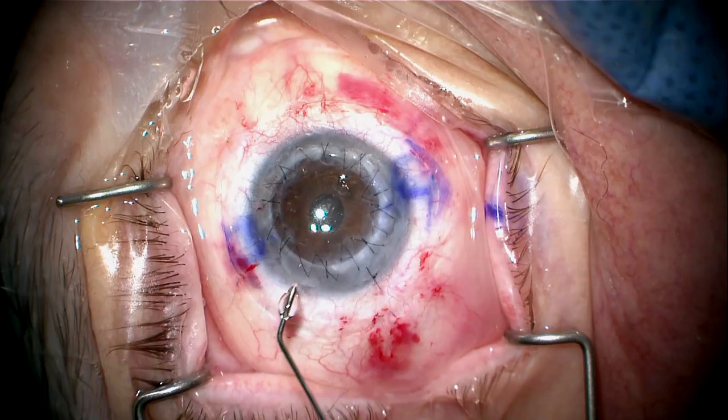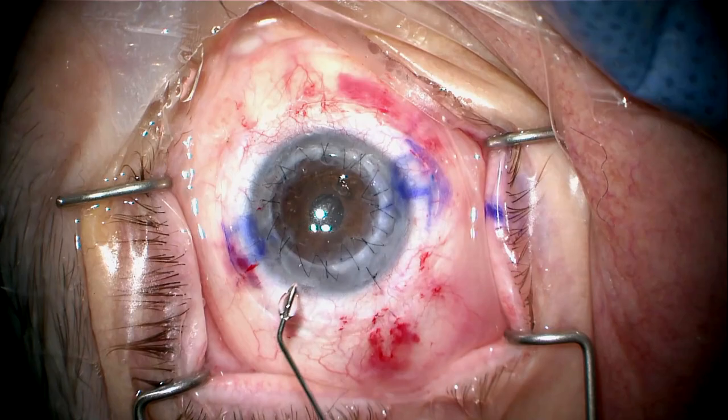I've adjusted the running suture to reduce astigmatism. I pressurize the eye, and this looks pretty good.